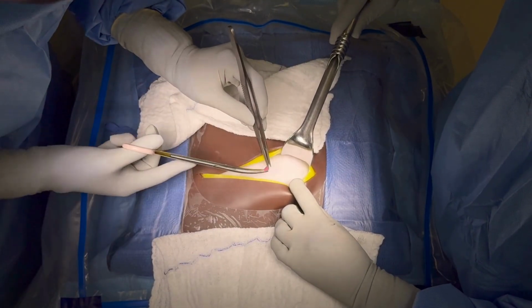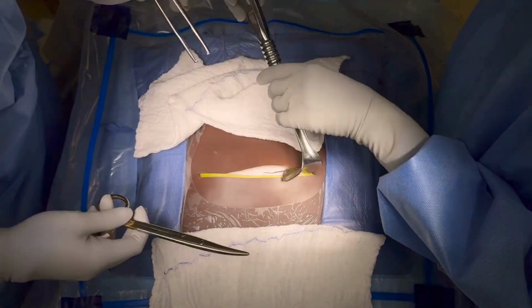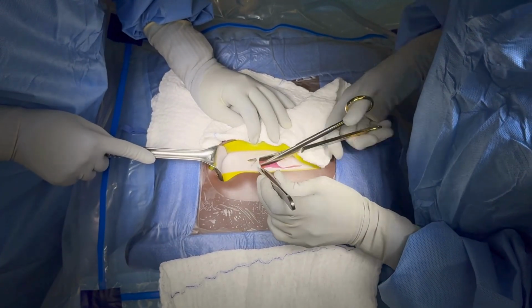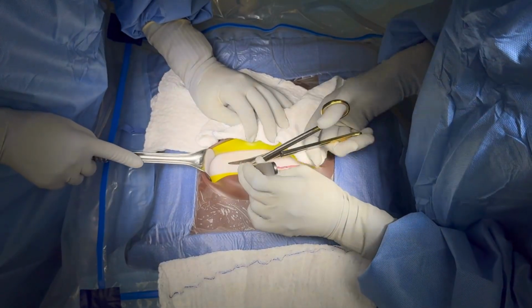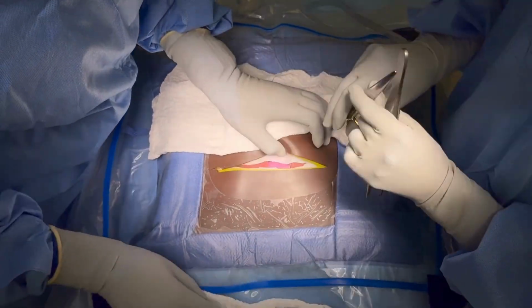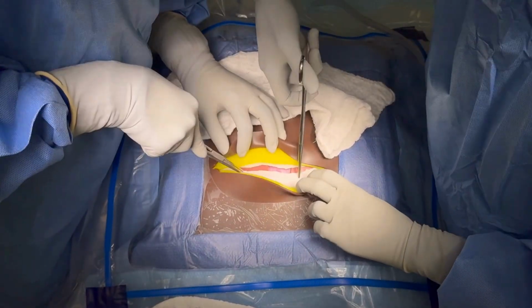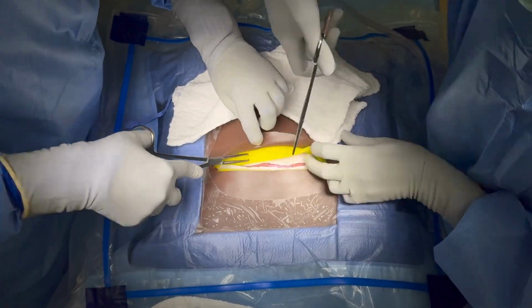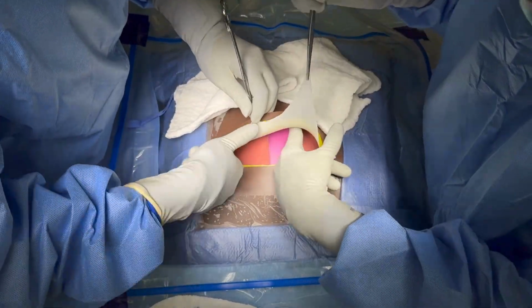Bonney pickups and curved Mayos are then used to extend the fascial incision laterally on both sides with the aid of the surgical assistant. Kocher clamps are then used to grasp the fascial edge in the inferior portion, separating the fascia from the underlying rectus abdominis muscles, and the same procedure is repeated on the superior aspect of the fascia as well.